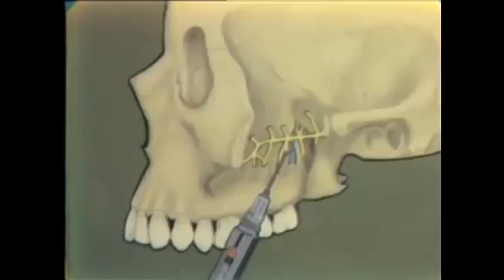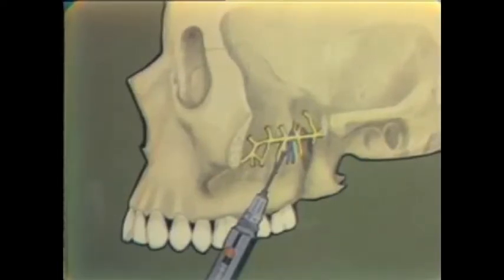The posterior superior alveolar injection is a distinct advantage. We'll let Andy close here for just a moment. A distinct advantage where that malar strut lies over either the first or the second molar, and you anticipate instrumentation on that tooth, and it just affords too much of a barrier for a buccal infiltration of that particular tooth to get through, or for the solution to diffuse through. And there are occasions when the posterior superior alveolar block is needed to afford good anesthesia of either the first and/or the second molar, depending upon the site of the malar strut in relationship to the particular tooth.